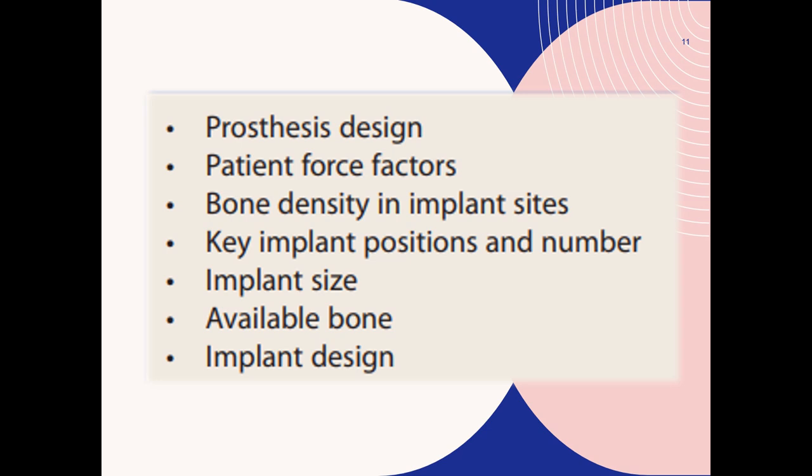Next, coming to the implant position and number. So, in any prosthesis, implant position is more important from a stress management perspective, and we know that cantilevers are a force magnifier. So our implant position should aim at the elimination of cantilevers whenever possible, especially when other force factors are increased. And we know that increasing the number of the implants increases the overall surface area and thereby helps in reducing the stress to the implant system.